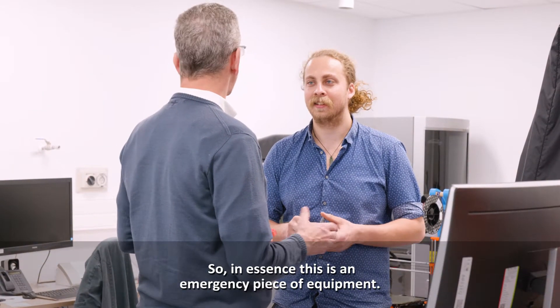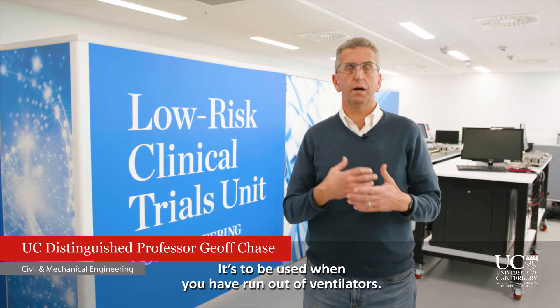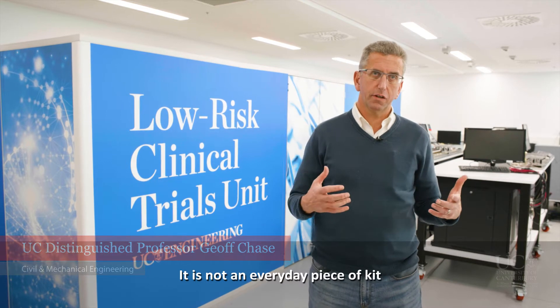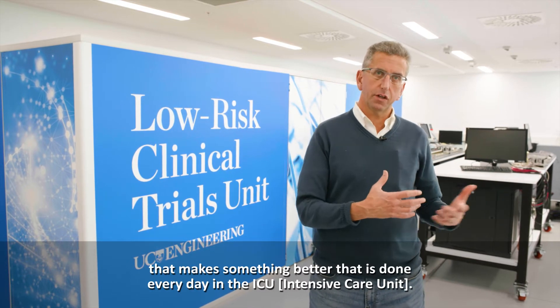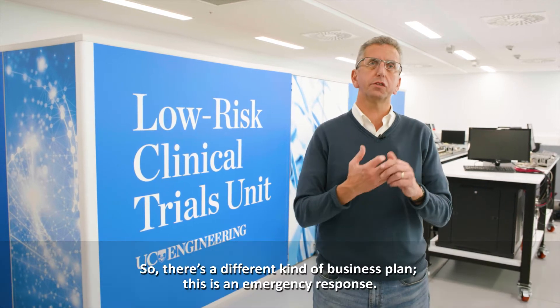In essence, this is an emergency piece of equipment to be used when you have run out of ventilators. It is not an everyday piece of kit — it's not something done every day in the ICU. So there's a different kind of business plan; this is an emergency response.